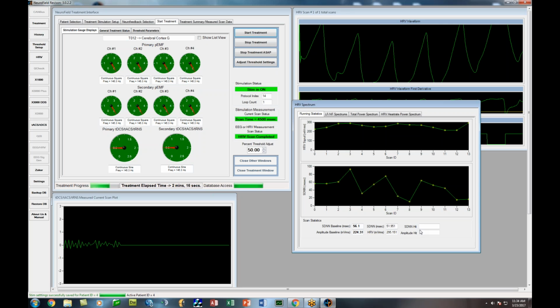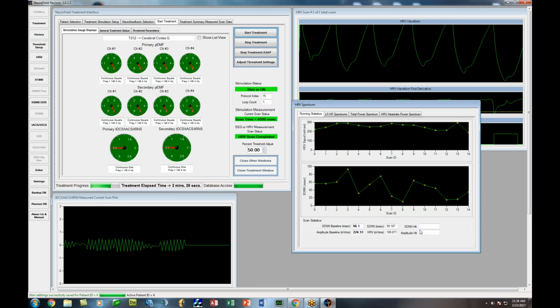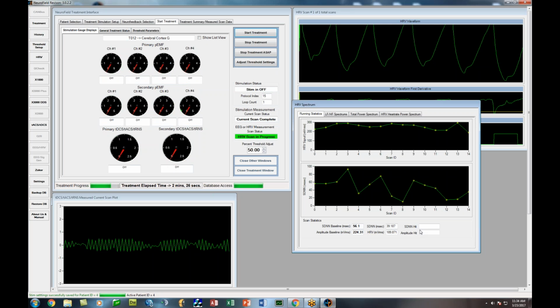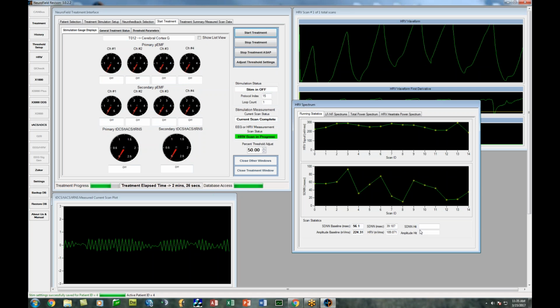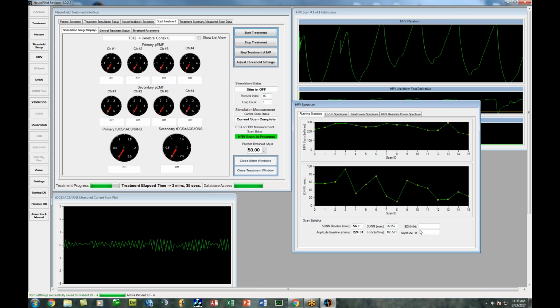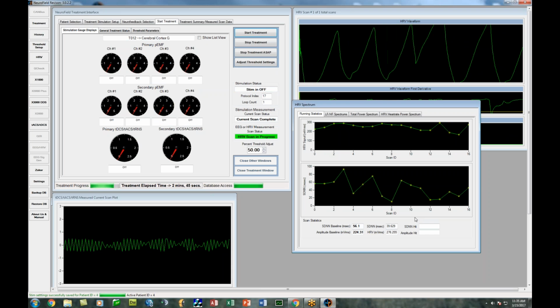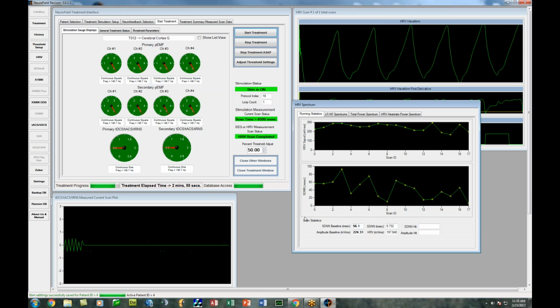Annie did this with Sophie, and you gave her tissues. Was it the tissues protocol? And so she gave tissues and treated her that way. Then what'd you do after that? And then she gave the analgesic protocol in the Nogier database. That had a really profound effect on Sophie. Actually, she had some nerve damage where she had numbness, and apparently it resolved it, where she was able to feel her leg again, which is kind of cool. In one 15-minute session, I'm being told. I was here. I saw it. It was beautiful. All right.